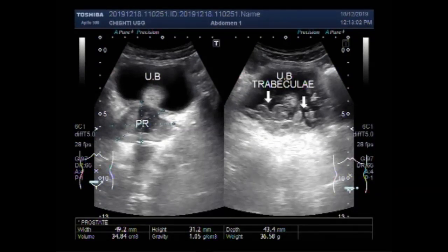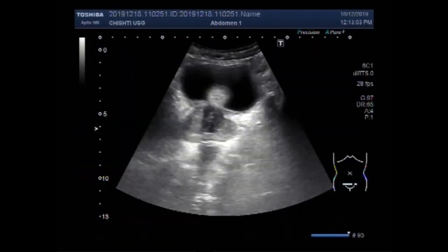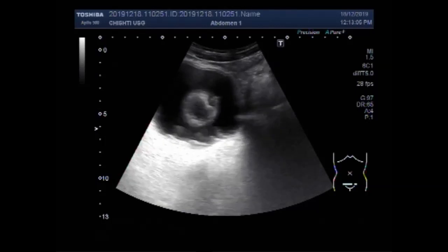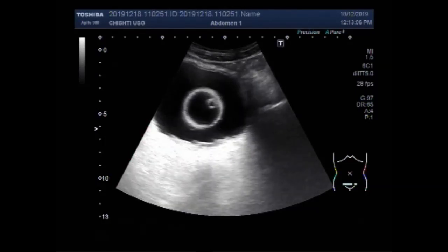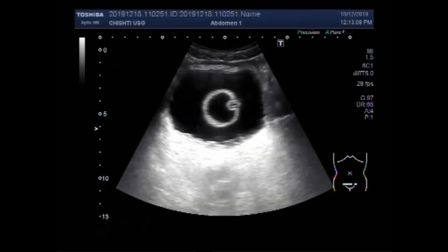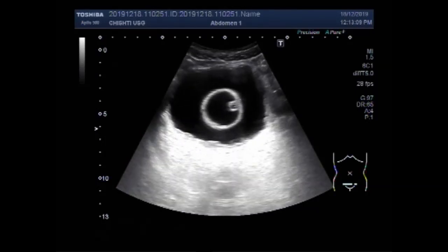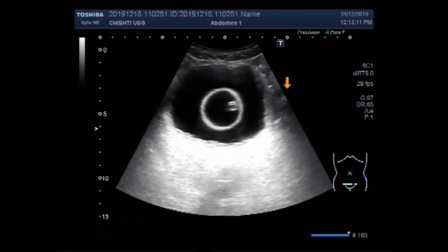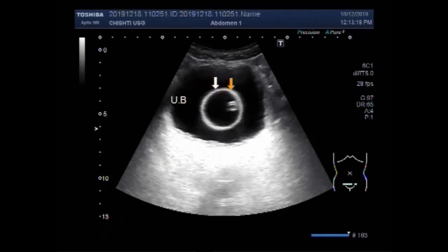This ultrasound video shows an enlarged prostate with urinary retention and a trabeculated urinary bladder. You can see the balloon of the catheter, as the patient was suffering from urinary retention.